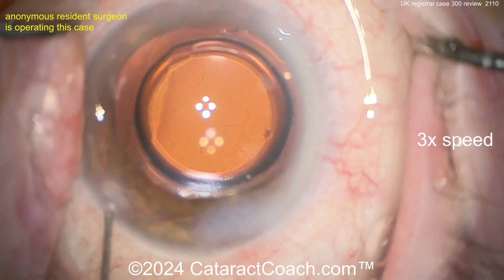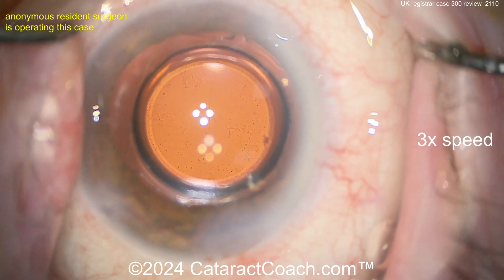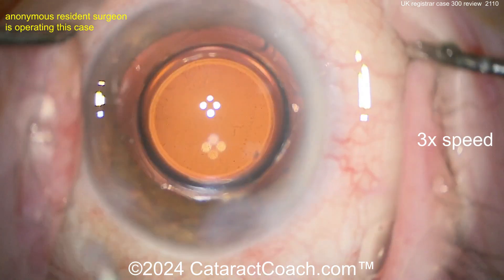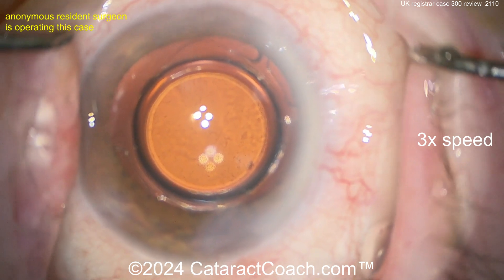Maybe it's time for you to start looking at the refractive outcomes for these patients. Where was the steep incision for the astigmatism? Did you make your phaco incision on that axis? Where do you need to place an LRI? You've got to learn how to do the LRI — the refractive part of cataract surgery.